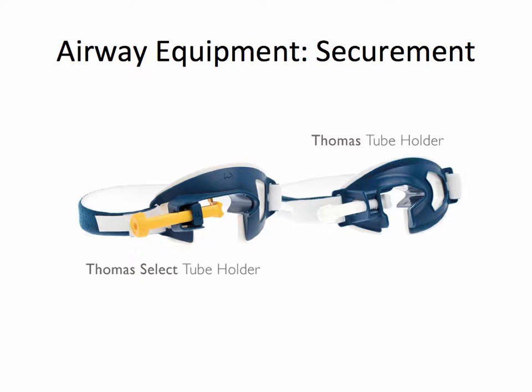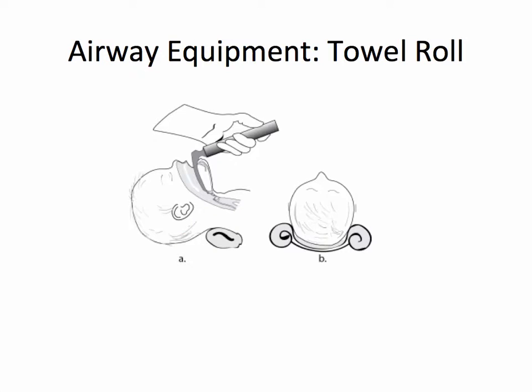Note that if the endotracheal tube is taped to one side of the mouth, it should be moved at least once daily or per hospital policy in order to prevent skin breakdown at the corners of the mouth. Finally, a towel should be available for pediatric and obese patients. Placing a towel under the shoulders can help align the airway for better visualization of anatomy.